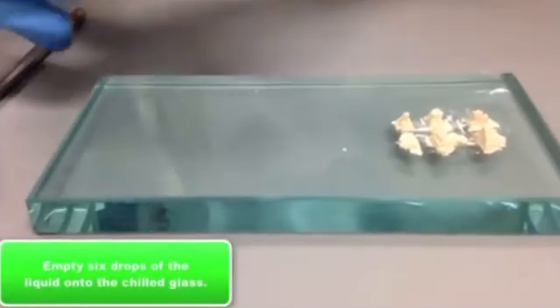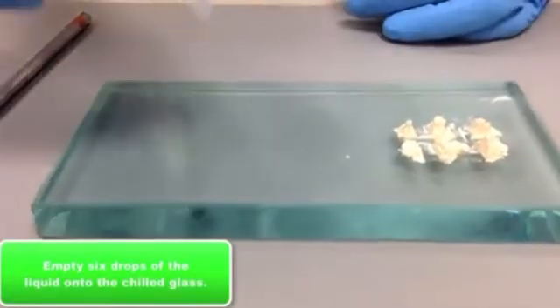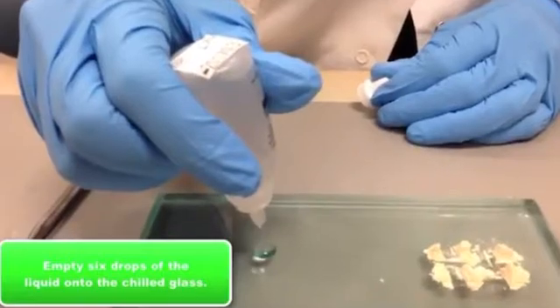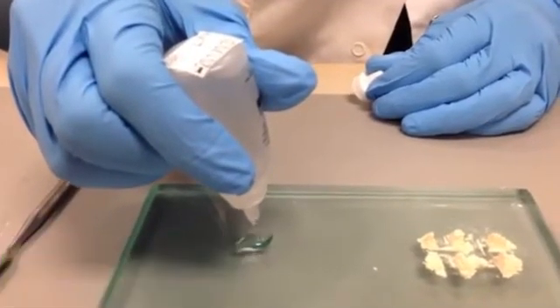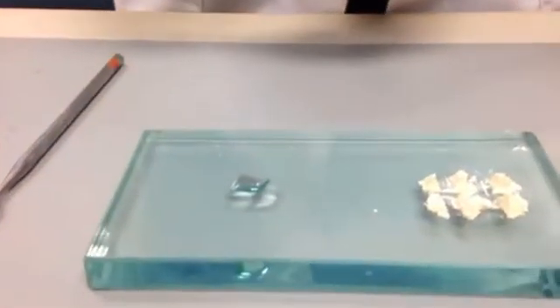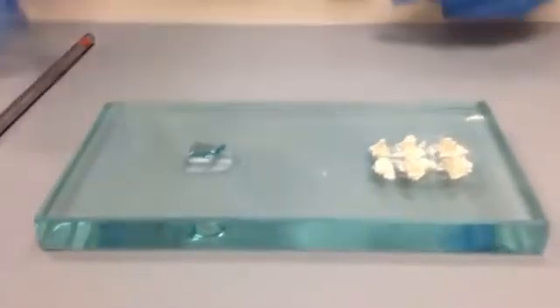So the next step is to empty six drops. You want to turn the container completely upside down and let six equal sized drops fall onto the slab. And now you're ready to mix.